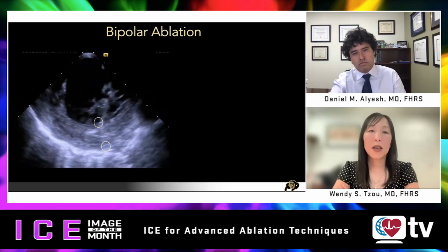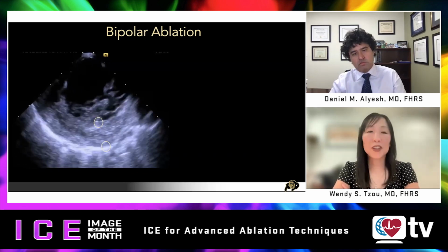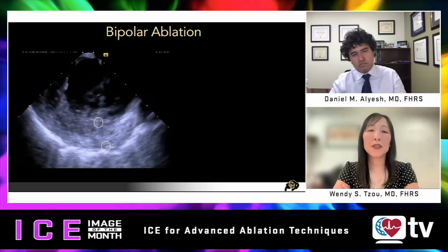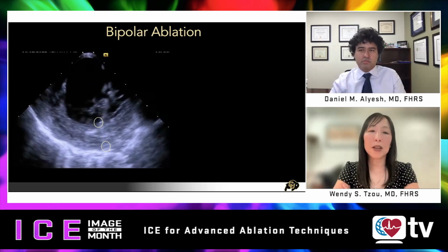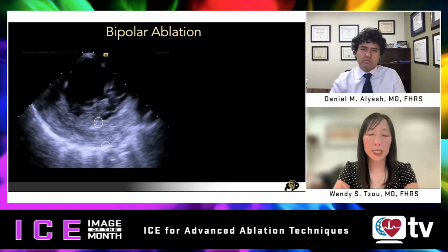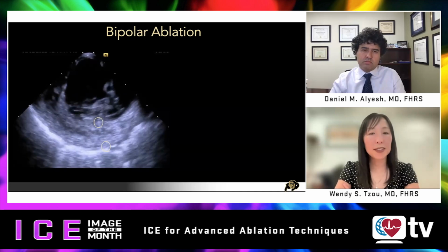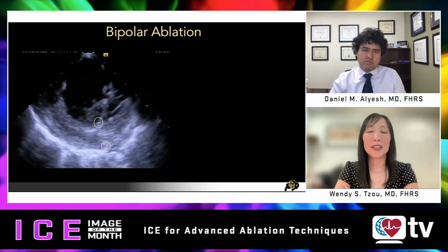of the catheters. When you try to do this using many electroanatomic mapping systems, it is often difficult to see both catheters at the same time. I would say that there's perhaps one in which you can see both easily. But in the absence of that, you're stuck using fluoro. And in this case, one of the catheters is at least kind of pinned in position on the epicardium.